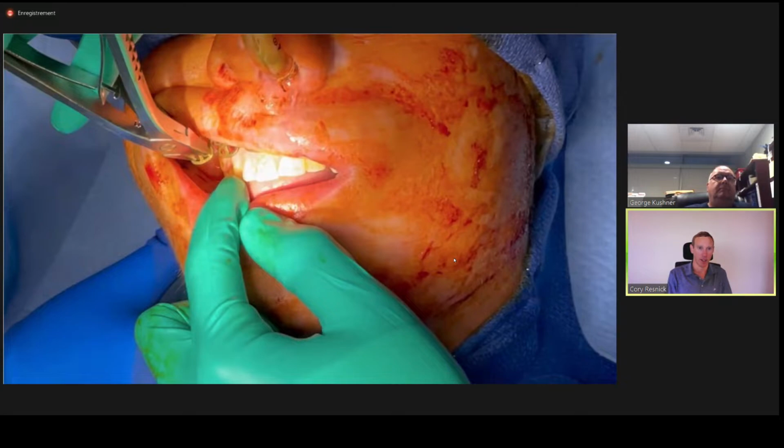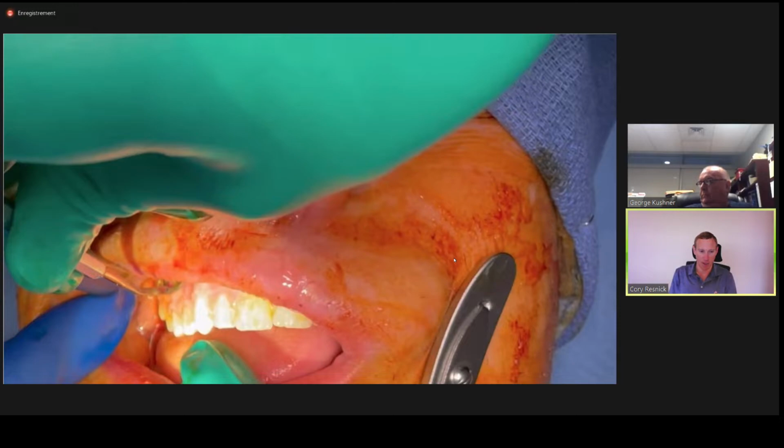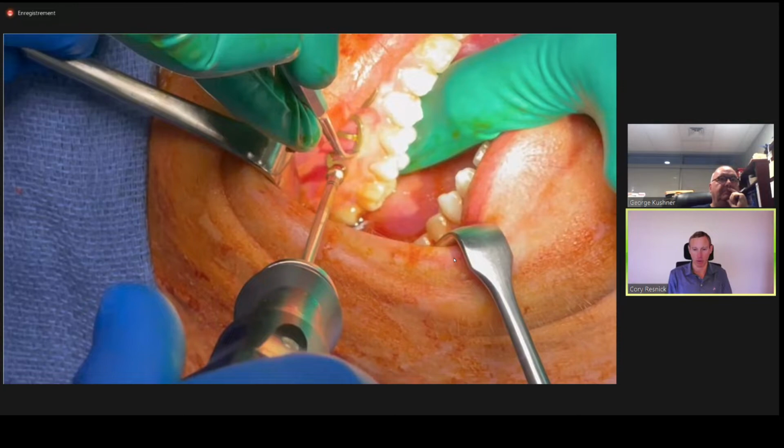And this is a little plier that's used to spread or contract the arch bar so that it fits properly, which is helpful as you try to navigate the holes in the arch bar to make sure that you can apply those screws without causing root damage. This one in the Wave system does allow you to expand or contract the arch bar a bit to try to get those holes positioned where you want them to cause the least possible damage. And so I do like this particular one, although the other hybrid arch bars available are also excellent.